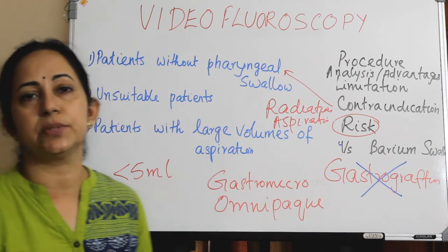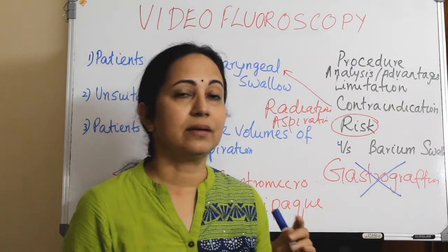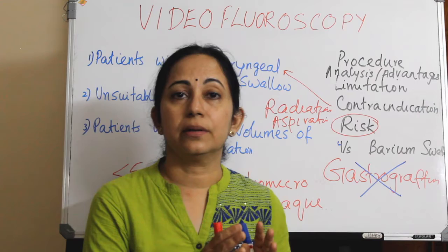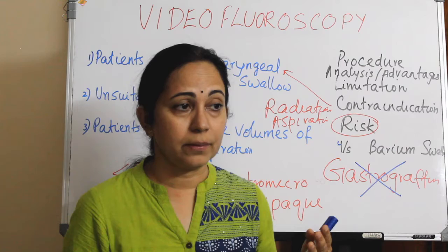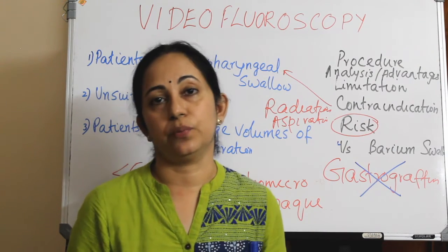And what is the difference between this and a conventional barium swallow? You have seen barium swallow films, and it is mainly done by radiologists, and it is mainly for the distal problems, that is esophageal motility disorders, strictures, pharyngeal pouch, etc., and also the more distal part of the esophagus.